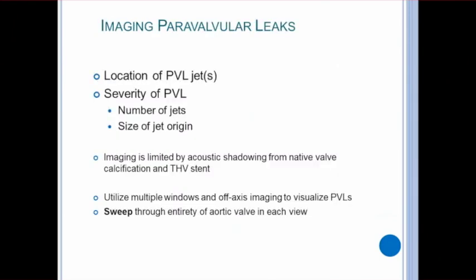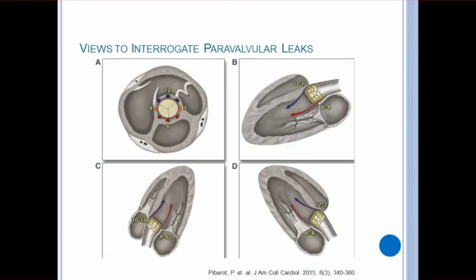It's crucial to look for any paravalvular leaks. There is a high mortality rate in TAVR patients with even mild paravalvular regurgitation. Regurgitant jets are typically eccentric, irregularly shaped, and often multiple, so sweeping through the plane of the aortic valve in multiple views is critical. Acoustic shadowing from the native valve or bioprosthesis can make it challenging to find paravalvular leaks, especially those posterior to the valve in the short axis view. This is why it's important to use all possible views of the aorta. To interrogate the posterior side of the valve, the long axis views can be very useful. Scanning the parasternal long axis, the apical 5, and apical 3 chambers can provide the proper angulation to evaluate the entire posterior side of the valve for paravalvular leaks. Sweeping completely through the valve in each view is a must.